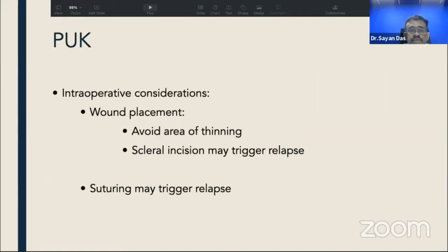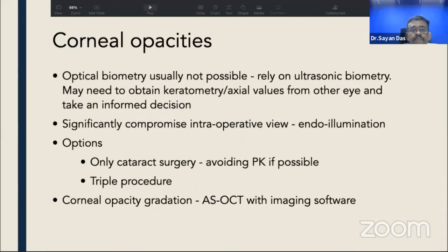And in intraoperative consideration, the wound should be placed while avoiding the area of thinning, and scleral incision may trigger relapse. So we should ideally avoid scleral incision and go for clear corneal incision. And also suturing may trigger relapse, we need to remember.